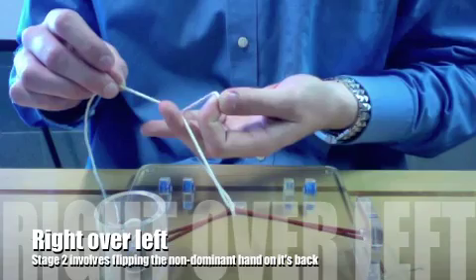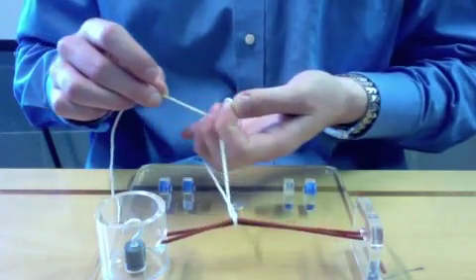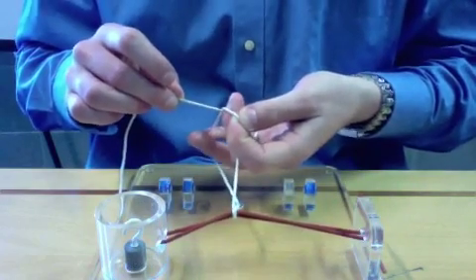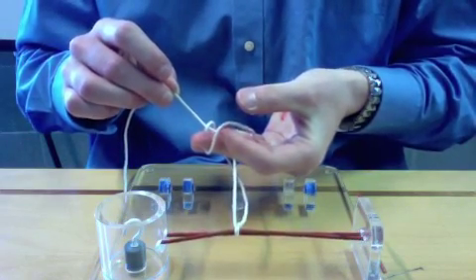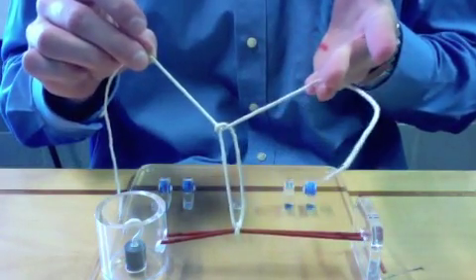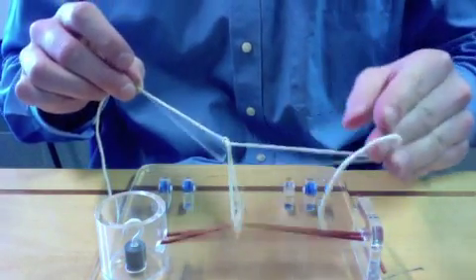I hook the right string with my left middle finger, pull the right string lateral to the left string, push the left string so that it falls between my middle and ring finger, then pull it through the loop and tighten it.